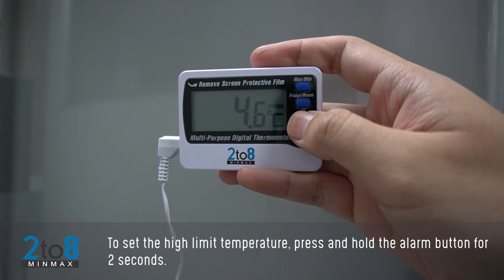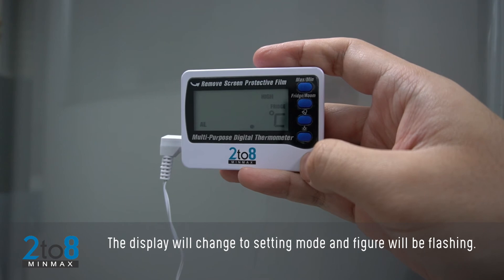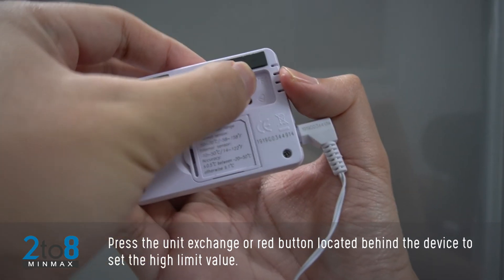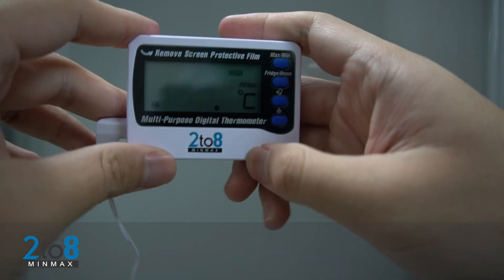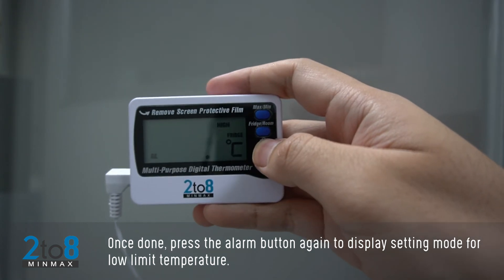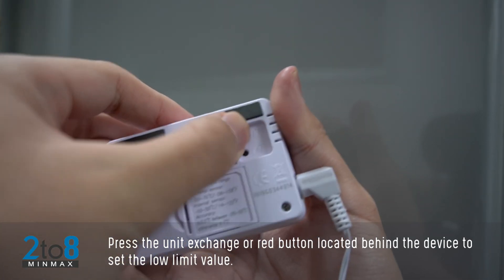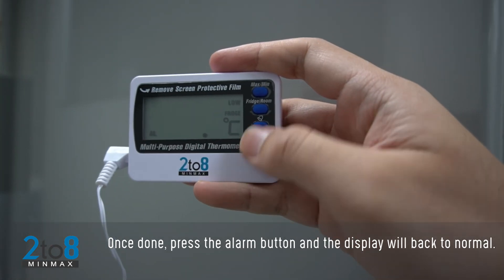To set the high limit temperature, press and hold the Alarm button for two seconds. The display will change to setting mode and the figure will be flashing. Press the Unit Exchange or red button located behind the device to set the high limit value. Once done, press the Alarm button again to enter setting mode for the low limit temperature, then press the red button to set the low limit value. Once done, press the Alarm button and the display will return to normal.